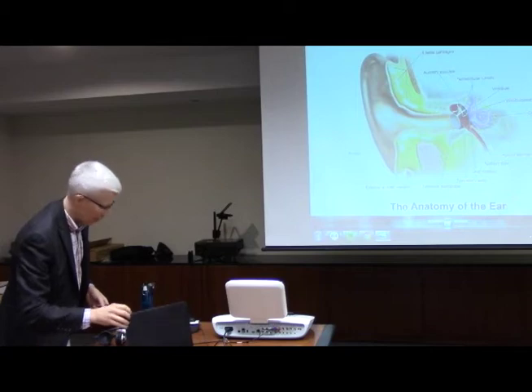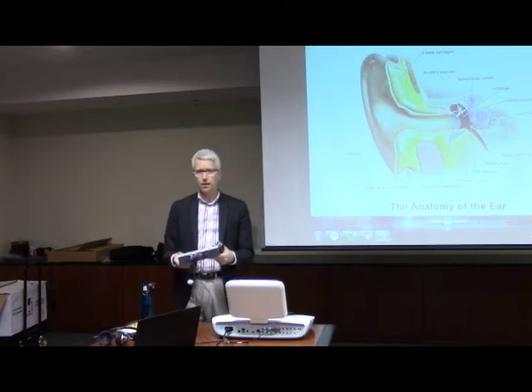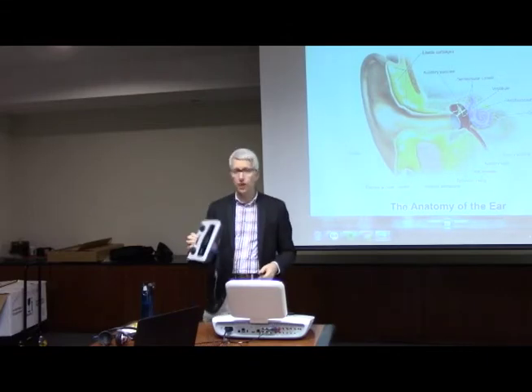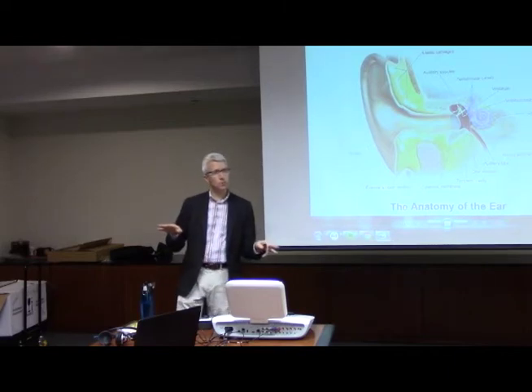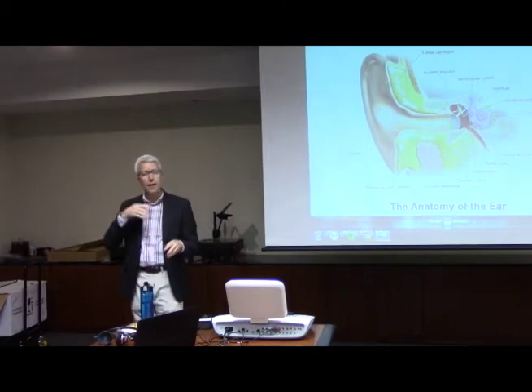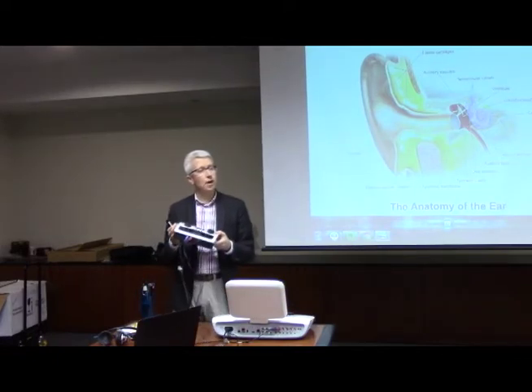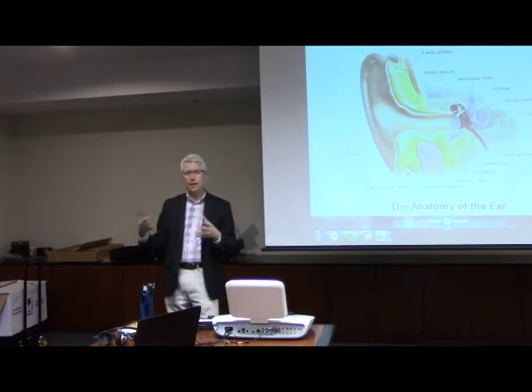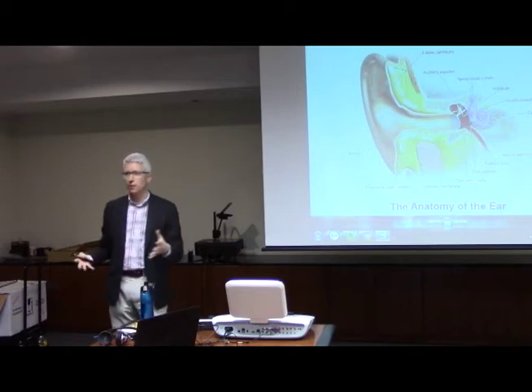Now, there is another type of audiometer that we sell, which you can tell just from the size of these, this one here, is much more basic, and it is only going to do the first part of the test, typically with headphones, only pure tone air conduction, so the headphones on, and no speech, no bone conduction. The purpose of this is to decide, does everything else need to be done or not? So this is usually done maybe in a pediatrician's office, maybe a general practitioner, somebody who isn't looking to decide, do they need a hearing aid, do they need medical treatment, that kind of thing. This is really more, do they need to go see somebody who may help them with something like that?